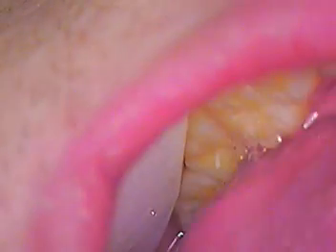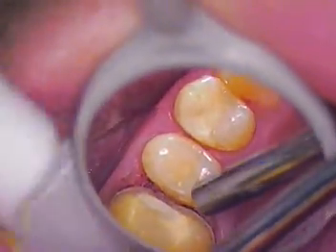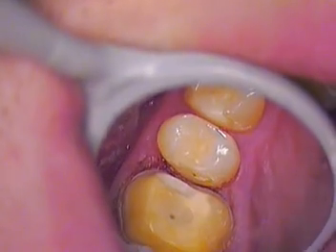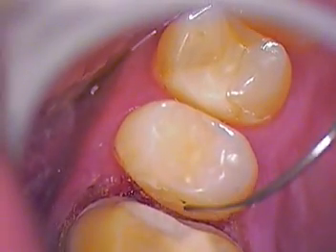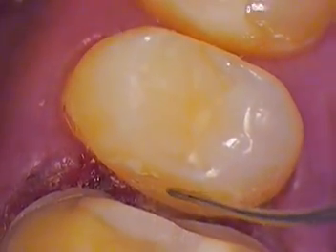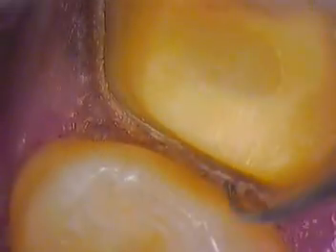While we're doing that, let me go ahead and dry this off. I'm just double-checking that contact area — it looks like just a surface imperfection of some type. It's a little debris of something. I'm going to zero in on it. It's been a restored area. It's not decay, I know that. It's smooth, so some kind of surface discoloration, but it's not decay. This contact looks perfect — we didn't touch it. It's natural. We'll leave it.